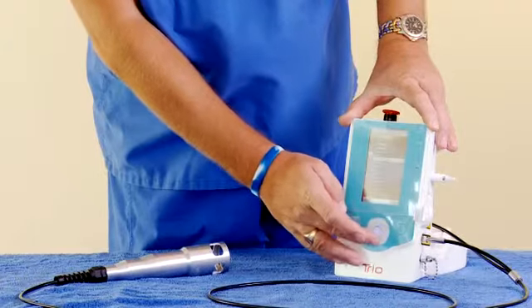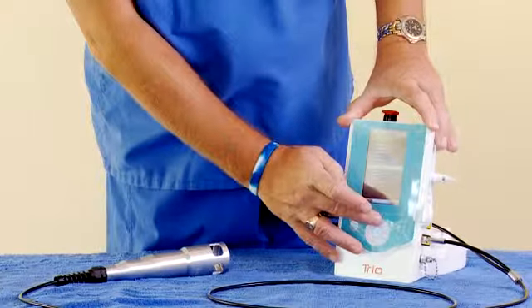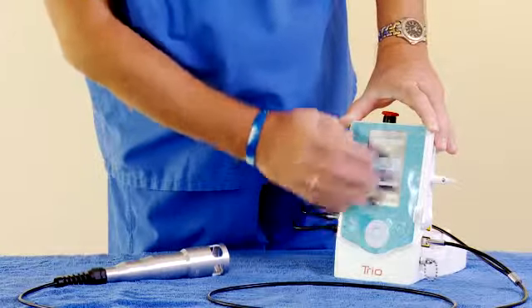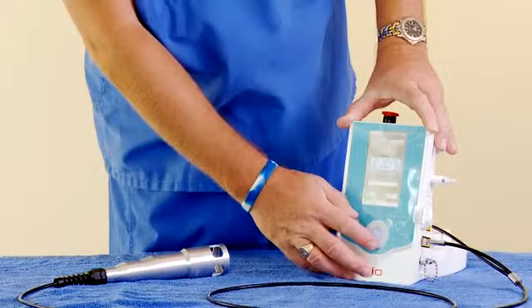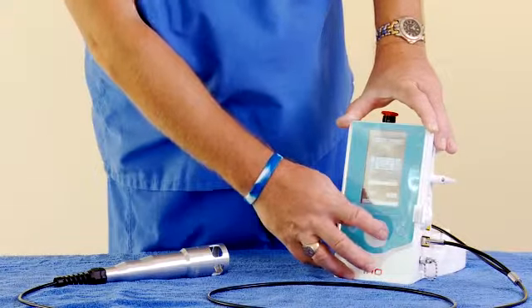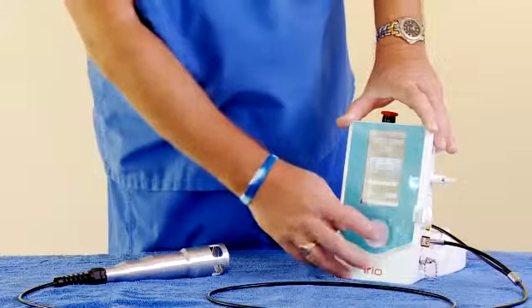I can also demonstrate that you can use this mouse device to choose your setting. And then you can also use the touchpad, or you can manually go down and adjust the power using the 4-way pad.